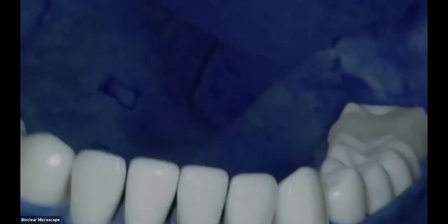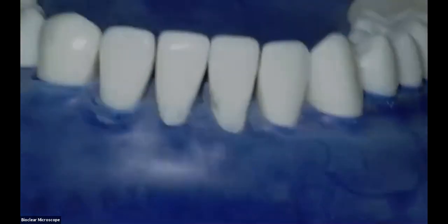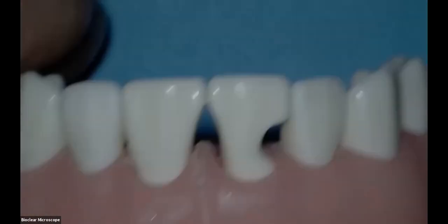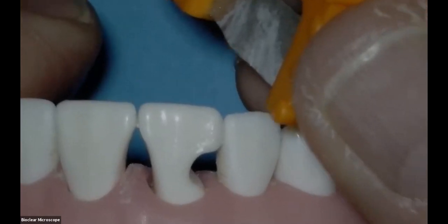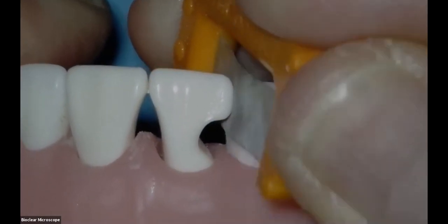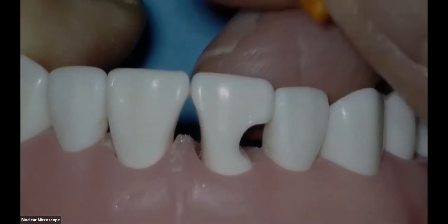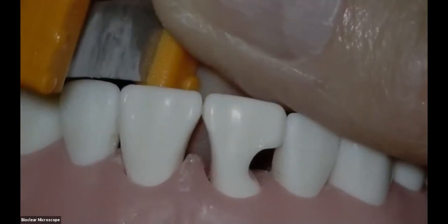So here's an example that we show at the Learning Center of a perfectly punched rubber dam that helps us keep the gingival margins perfect with Bioclear. But to get a rubber dam through the contacts, you have to take the true contact sander first. And before the rubber dam goes on, I know I'm going to have to optimize the contacts. The number one reason that we have a problem with Bioclear is because the matrices are not seated. And the number one reason we don't have a seated matrix is people did not optimize the contacts.